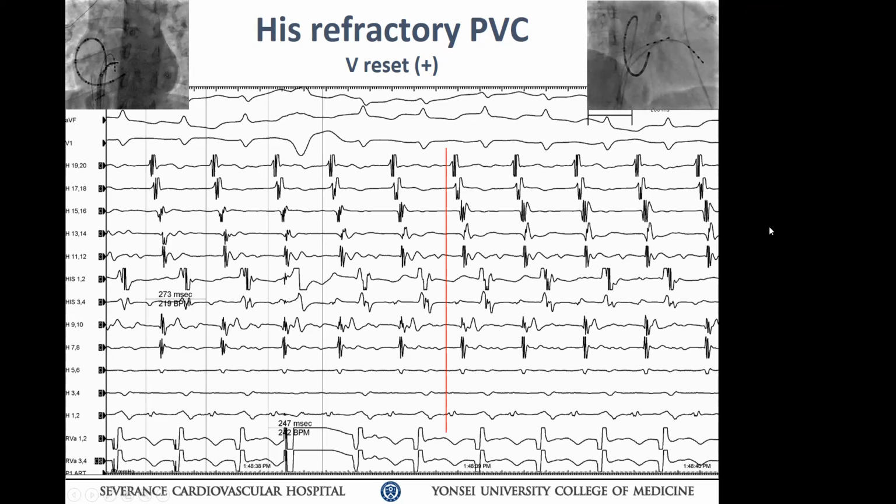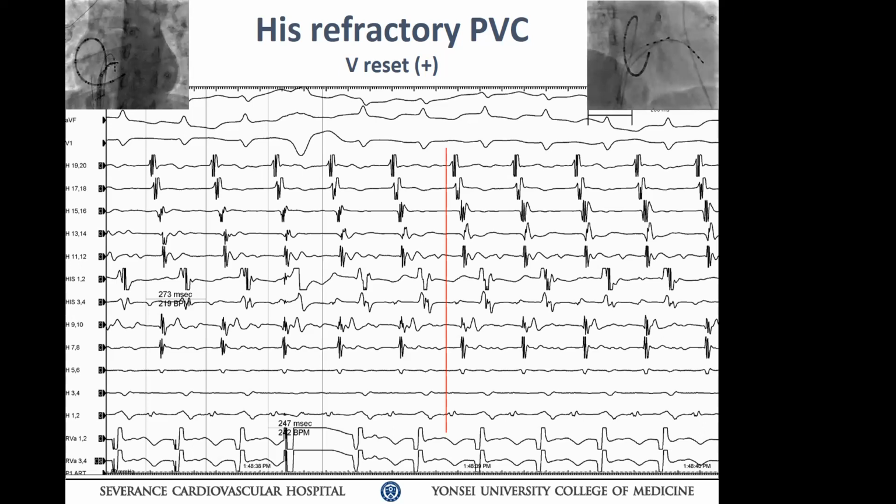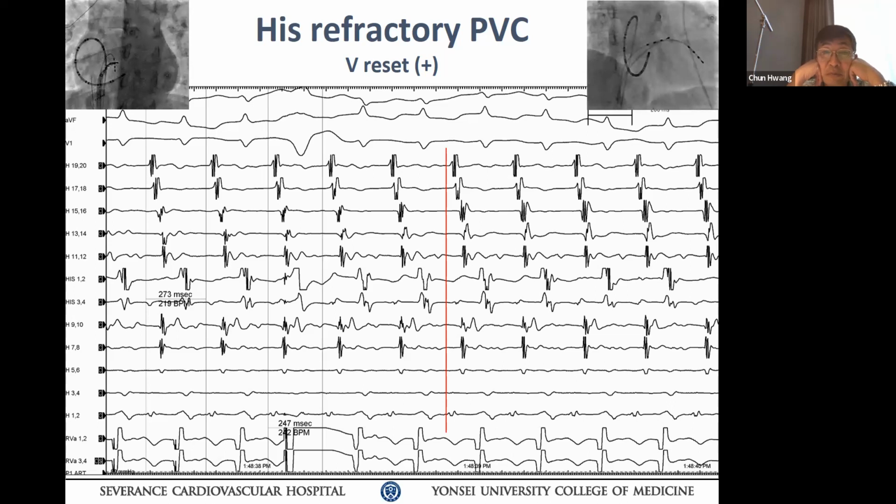그렇지. This patient had probably epicardial left posterior pathway. 네, 맞습니다. And you folks were never able to record the pathway potential, and then you create a bunch of lesion, create a conduction block proximally. So distal conduction is only maintained. So the only way the pathway conducts laterally, the first structure able to conduct epicardially would be ligament of Marshall, and then coming through the roof and coming down the septum. That's what you see here. Okay.